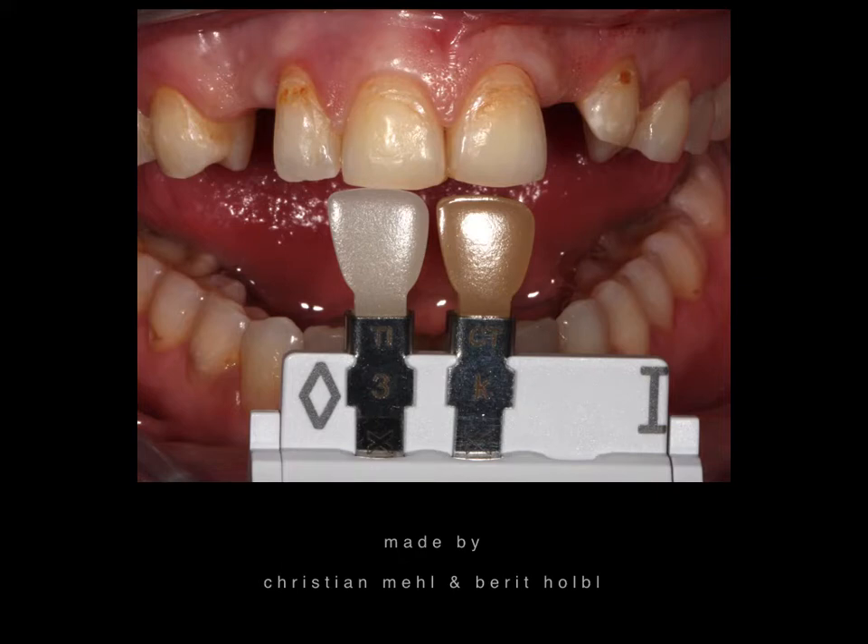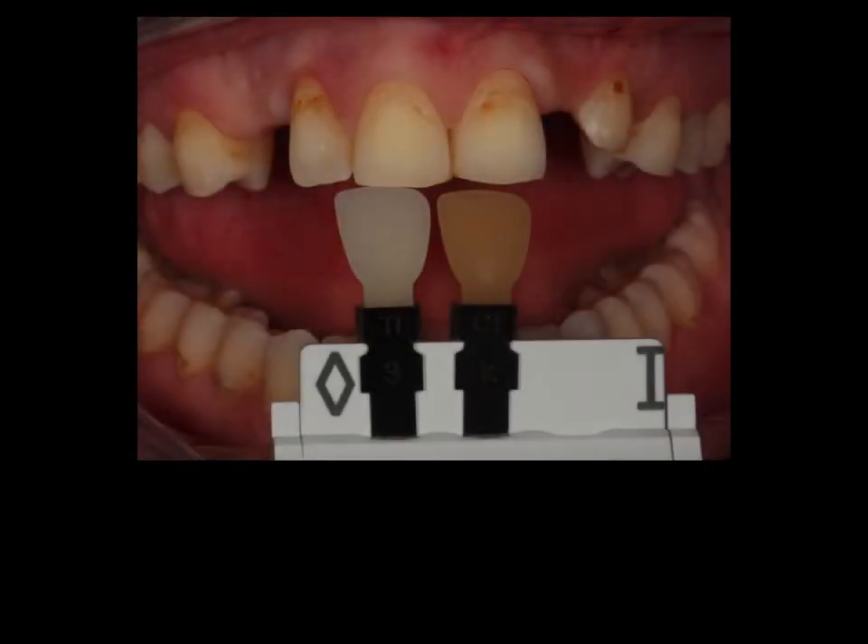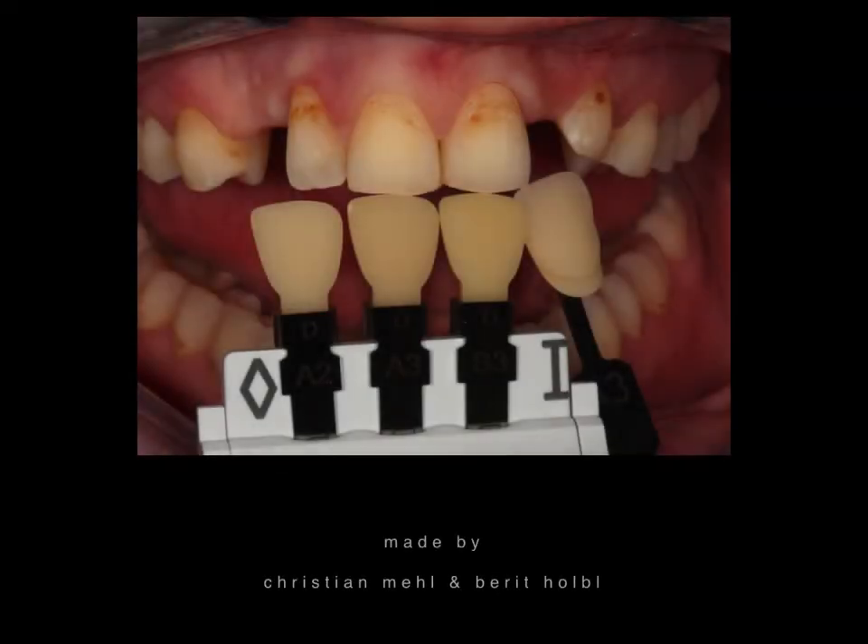We always try to minimize appointments. At the first appointment, we take color, and with this aspect we really take a long time — several color samples, a lot of pictures — to give the technician all the information they need. We take pictures with flash, without flash, with a polarized filter, and without a polarized filter, to truly give all the information the technician needs.